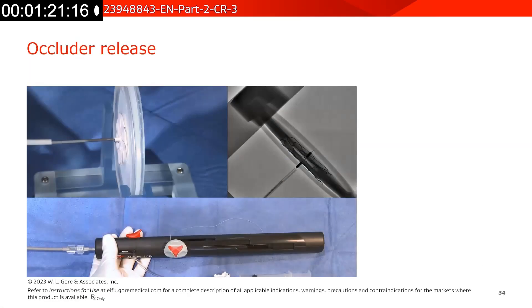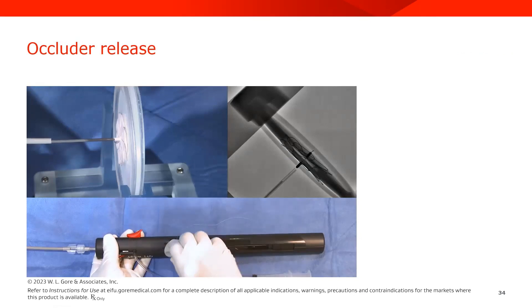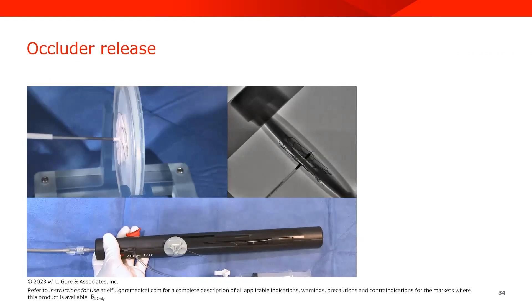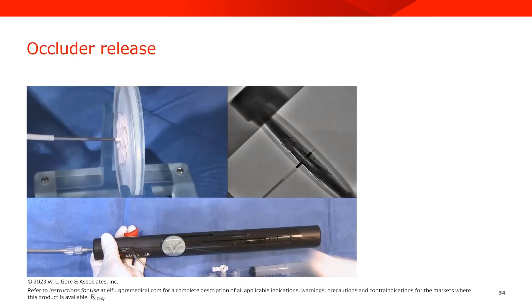To release the device in the heart, you will then remove the retrieval cord. And you will see the catheter fall away.